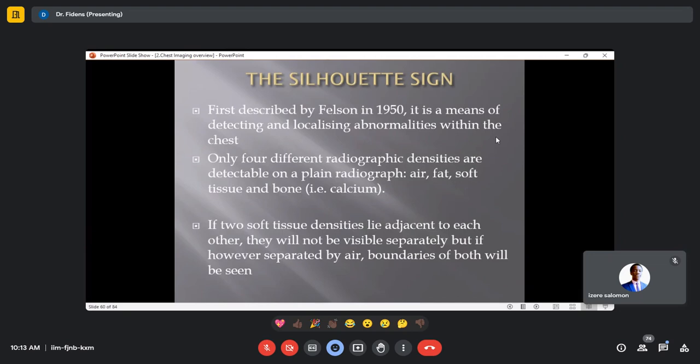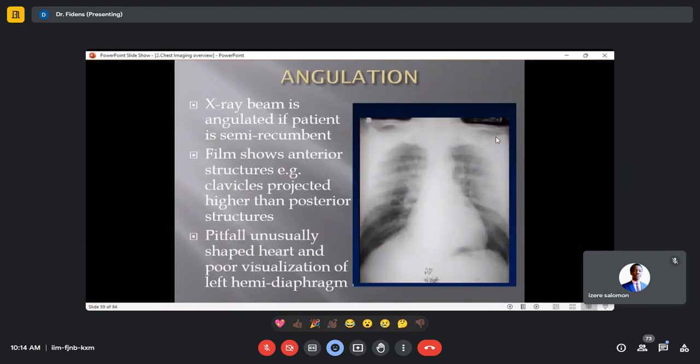So, something new for you. Try to listen to this, because it's very, very important. Okay? Who knows? Have you ever heard about the silhouette sign in radiology? Yes, you know it. Tell me what the silhouette sign is. Who told you about it?